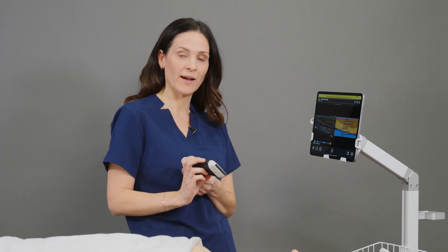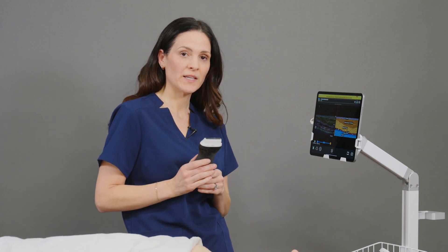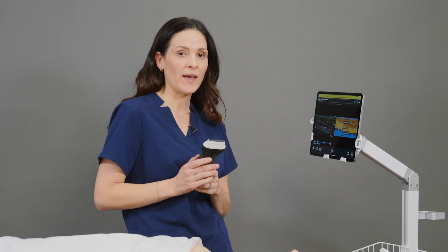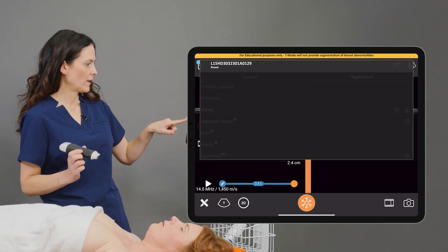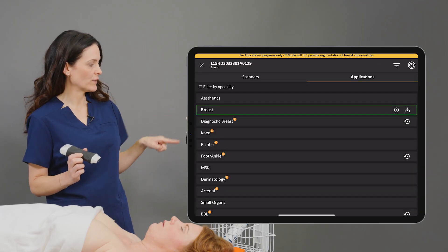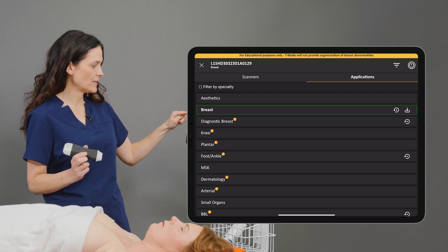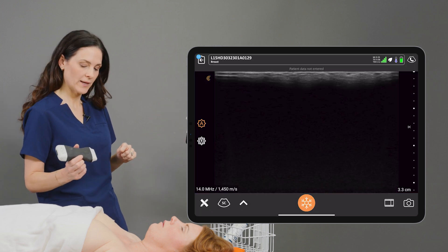Today I'll be using the L15 scanner, but T-Mode is also available on the L7 scanner. From the Applications tab, I'll choose one of the three breast presets, and I'll begin scanning.